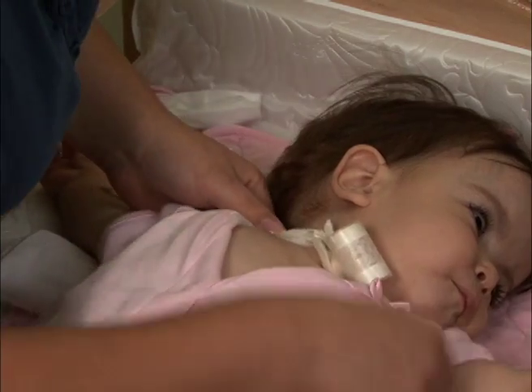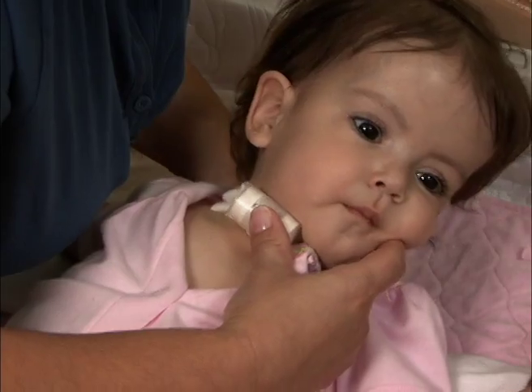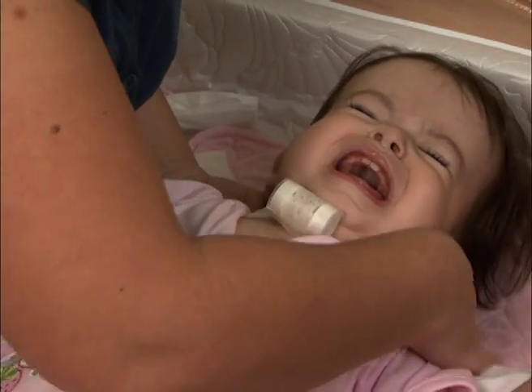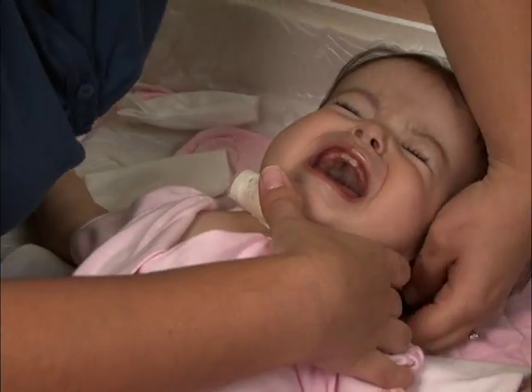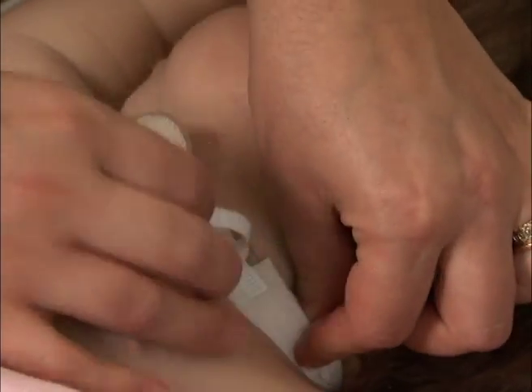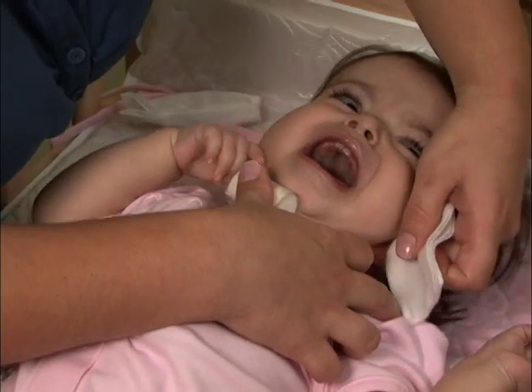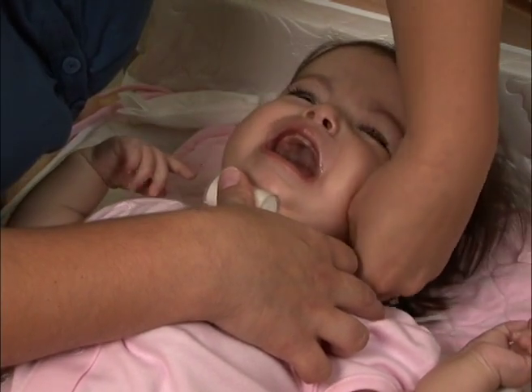Now, gently slip the old trach tie behind your child's neck and then the new one behind the neck. Move your child's head to the other side and remove the old trach tie, then wipe this side of the neck with the other damp gauze.